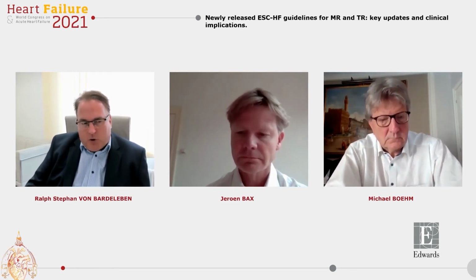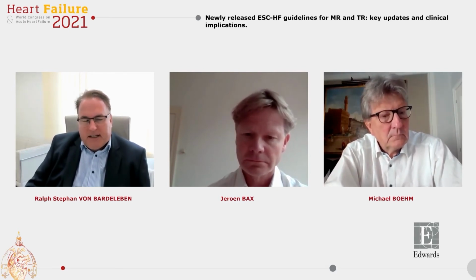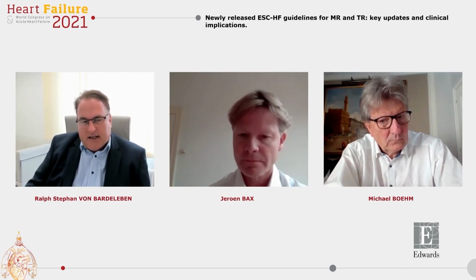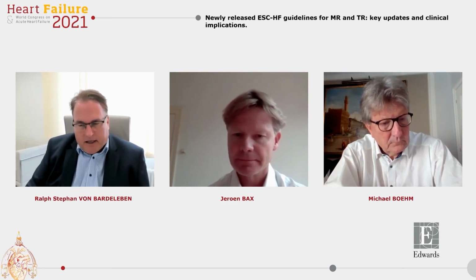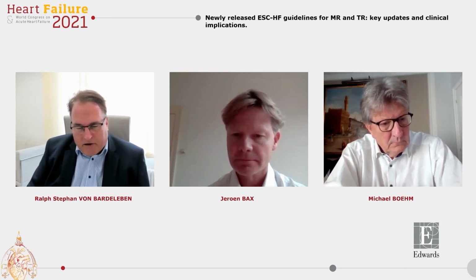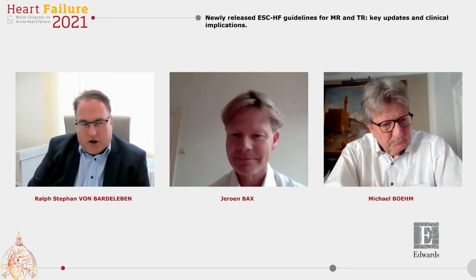And we also know from COAPT that the 1 month results of an improvement in the Kansas score predicts 2-year outcome of the patient. So mortality decreases. If your patient says, my combination of GDMT and valve therapy has improved my life at 1 month, then I will also survive at 2 years. And this is a hard endpoint, mortality.